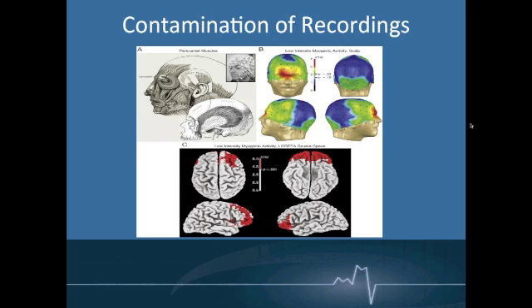Well, it turns out if you've ever looked up, if they have a BIS monitor running and they've got the little raw waveform trace, and you ever look up at it, you'll notice that the noise in your EMG on that channel matches the trace that you're seeing on the BIS, which you're actually recording. Think about where your electrodes are. You're recording frontal EEG, right? Frontal EEG. And when we talk about EEG in one of our next sessions, and we talk specifically about EEG patterns under anesthesia, you'll know that a lot of these faster rhythms occur frontally during anesthesia, all right?